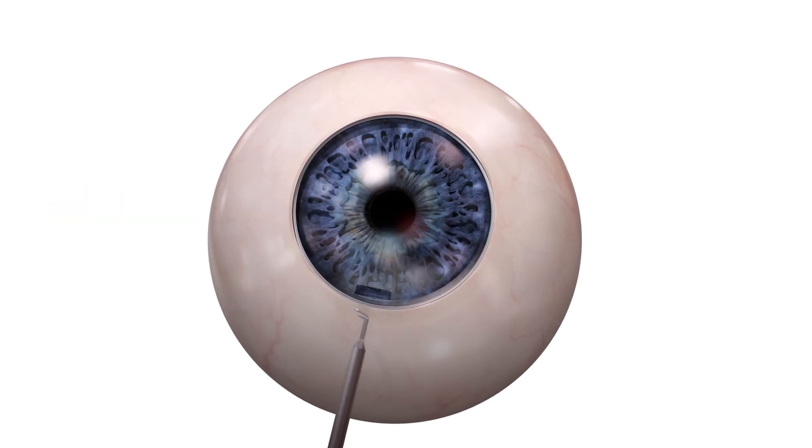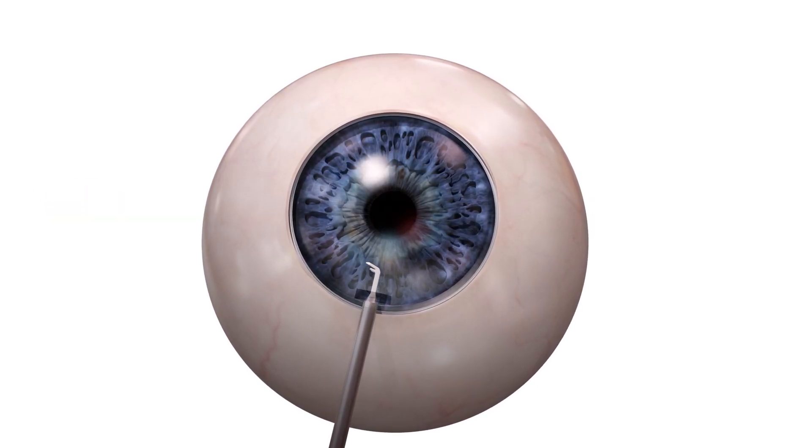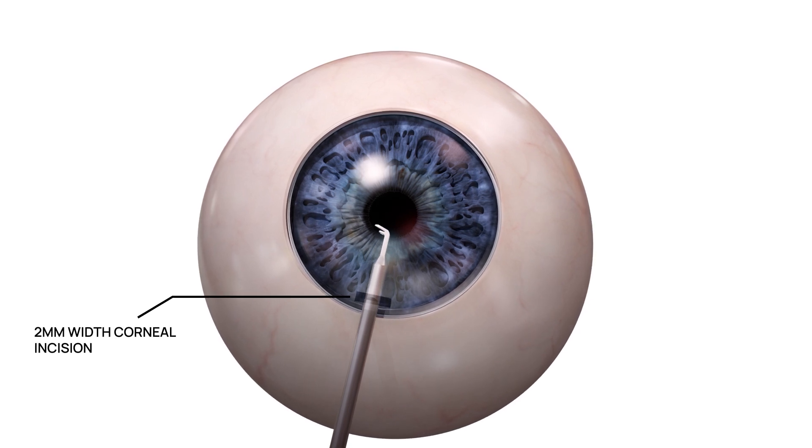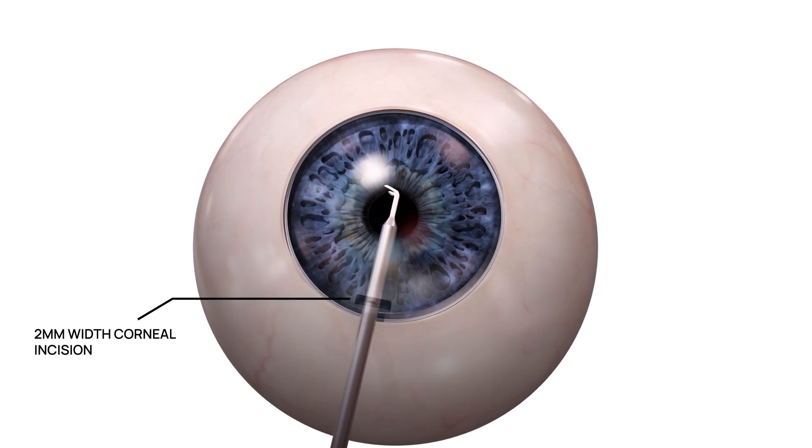To begin the procedure, Scion is inserted into the eye through a pre-existing clear corneal incision of at least 2 mm width.